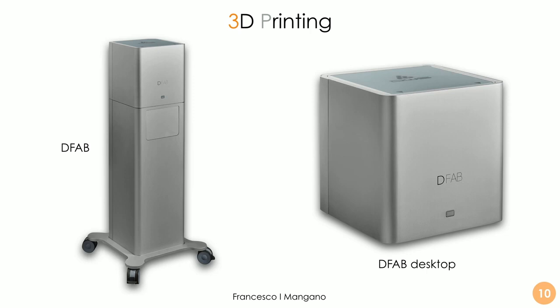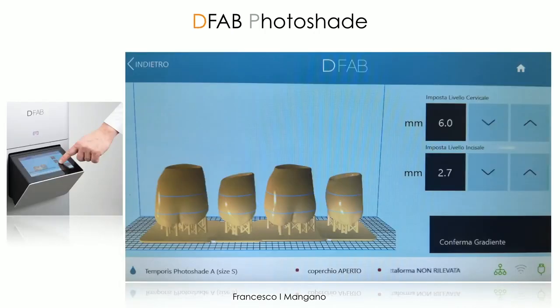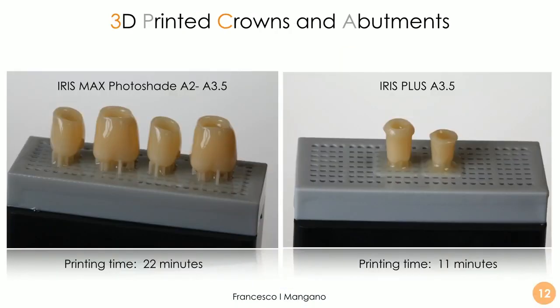It's important to highlight a very important possibility here. We simply transfer our STL file using, for example, a USB key and import the files into the software — the Nauta for DFAB photo shade. The dental assistant can usually do this very fast and predictably. Then we need to decide the color. We have three options: three layers of color — the occlusal portion, the mid portion, and the portion closest to the gingiva. In this case we chose an A3.5 to A2 restoration, and we also printed in Iris Plus — a monochromatic material — in A3.5 for the individual hybrid abutment.